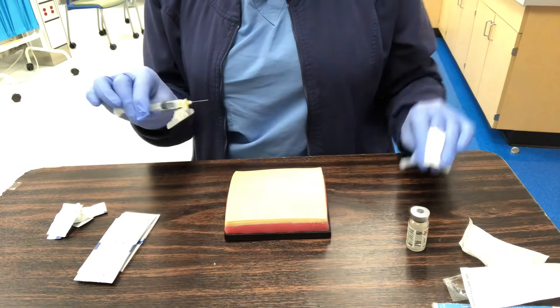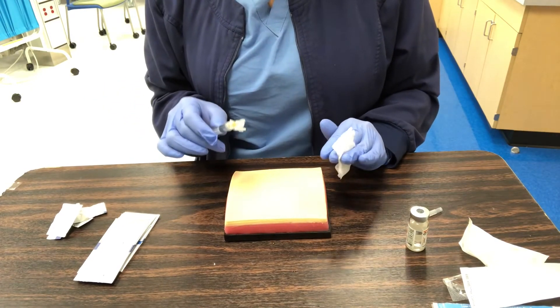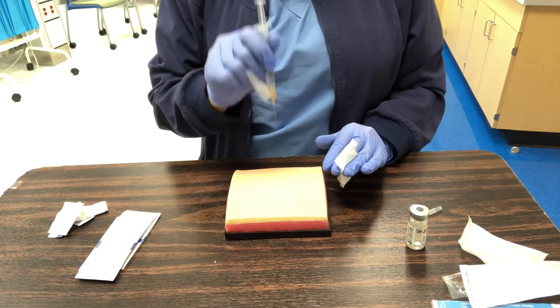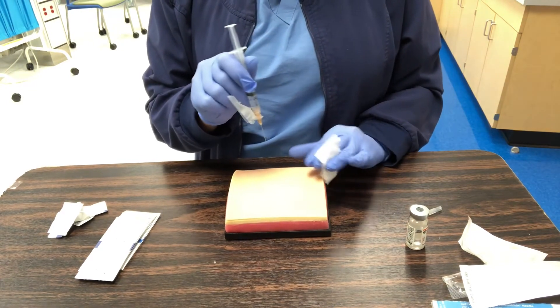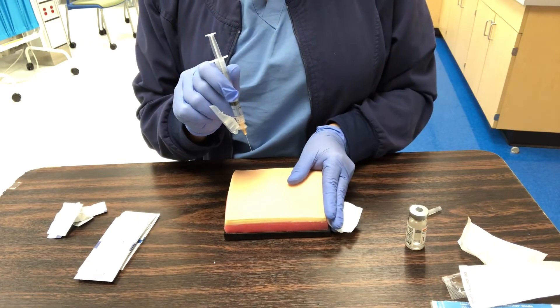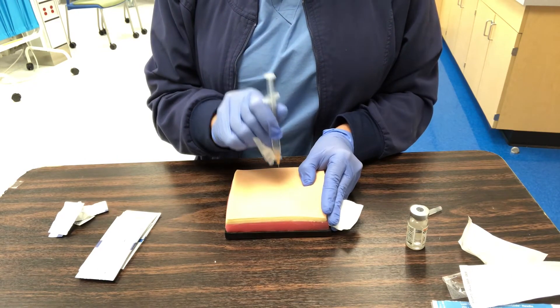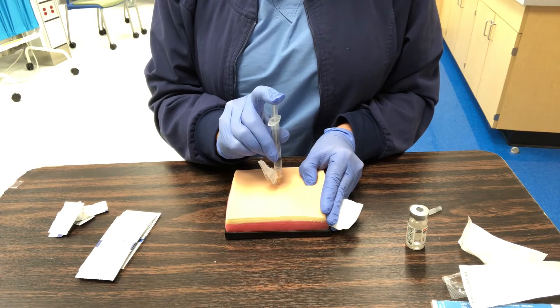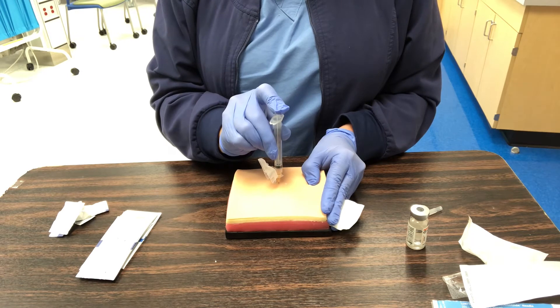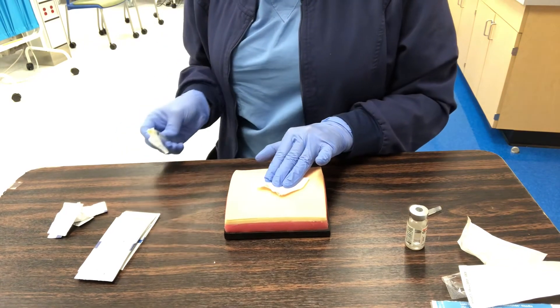I'll uncap my needle now. The question I always ask students is: do you want to be stabbed quickly or slowly? Quickly — and so does the patient. It's a 90-degree dart method. For the Z-track technique, I pull the muscle with my thumb, go in at 90 degrees with a quick stick, and gently push the medicine in.